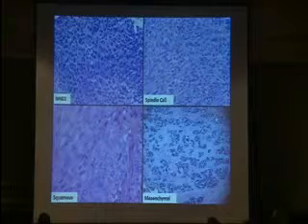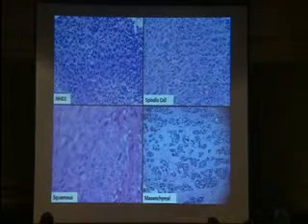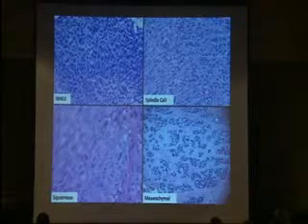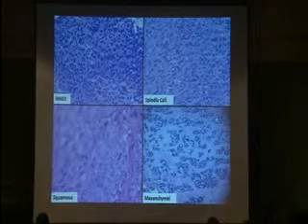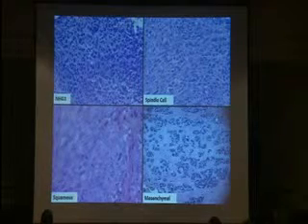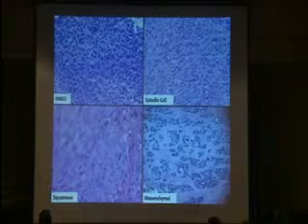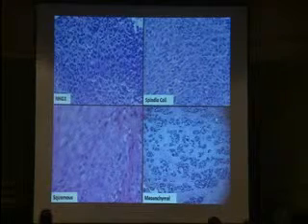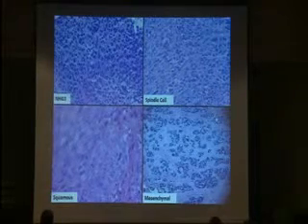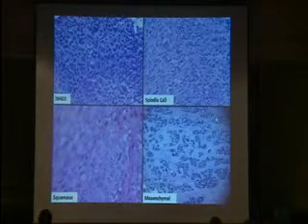And here's another example of metaplastic carcinoma, the squamous carcinoma. We see squamous cells, high nuclear grade, brisk mitotic activity. And this is an example of mesenchymal type of metaplastic carcinoma, where you can see the tumor starts to acquire heterologous elements, in this case cartilaginous differentiation in the form of a malignant chondrosarcoma.